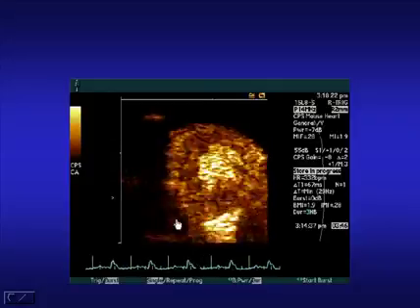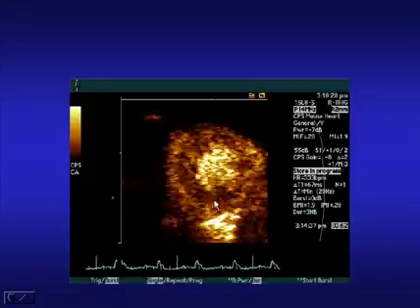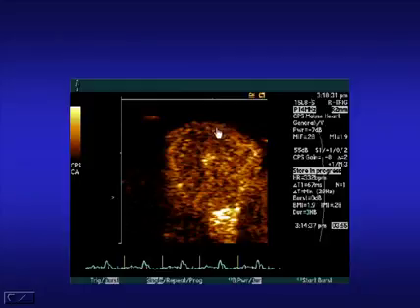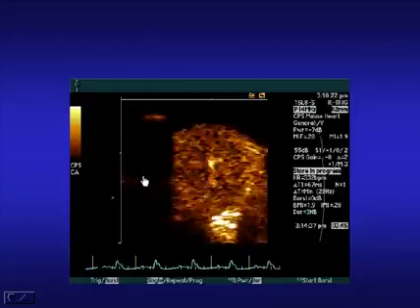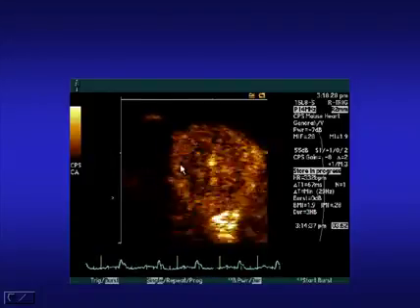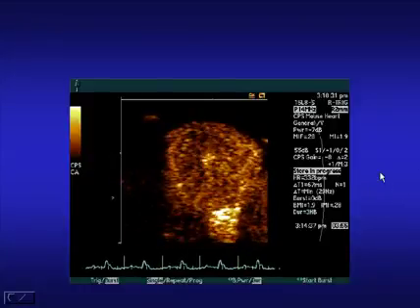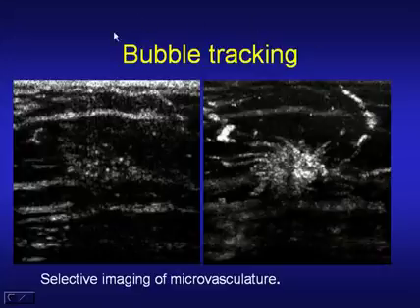And ultrasound contrast, as you see here, will not only demonstrate for us the chambers, but here you see bubble bursting, a high mechanical index pulse to purge the myocardium of bubbles. You can then look for reperfusion, and there you can see it occurring even on this millimeter scale. And this is translated into myocardial perfusion studies in man, where we can demonstrate the extent of infarcts really very effectively. We can also image selectively the microvasculature.